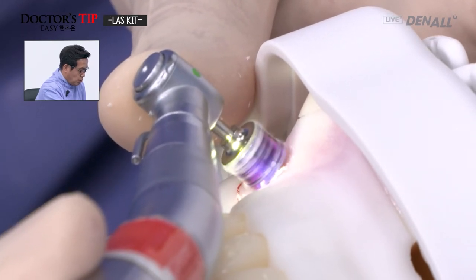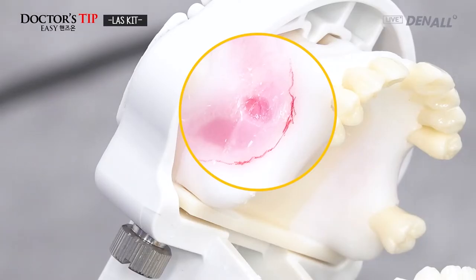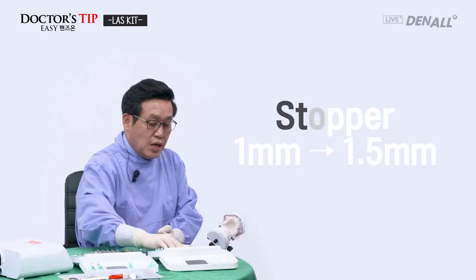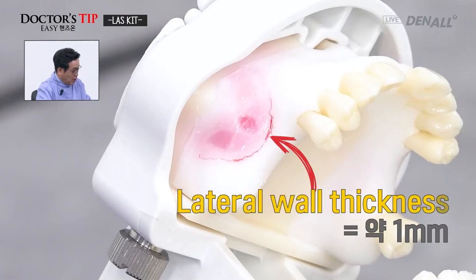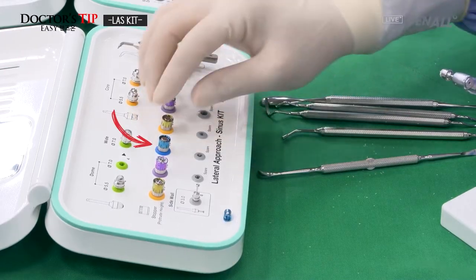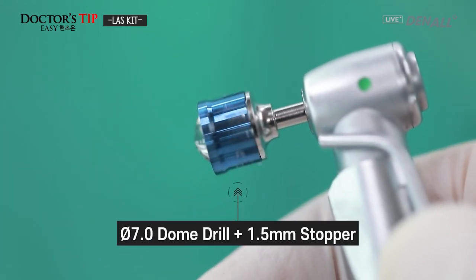Again, with the dome drill, the lateral window is ground. So as you can see, there is a bit of perforation, but it's still very thin. So I will use the 1.5 stopper. Lateral wall thickness is about 1mm, but there is a banded area. So I'll go now with the 1.5 stopper. So a 7mm diameter dome drill with a 1.5 stopper.